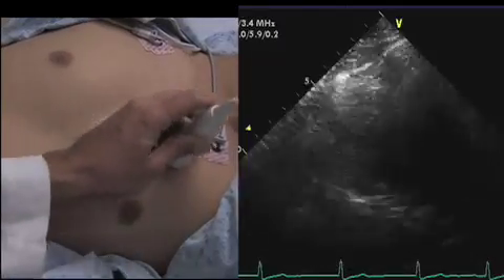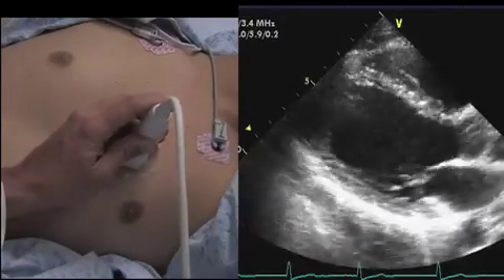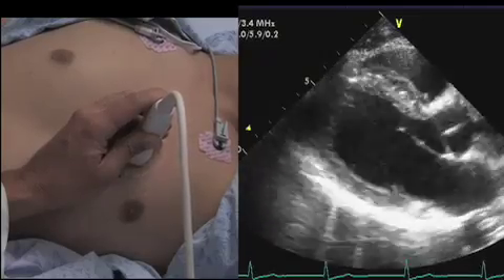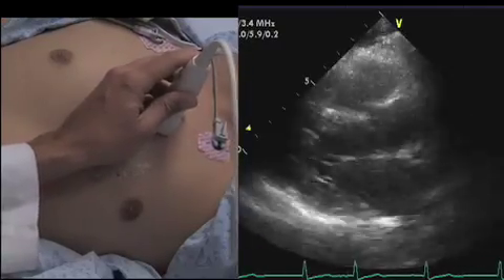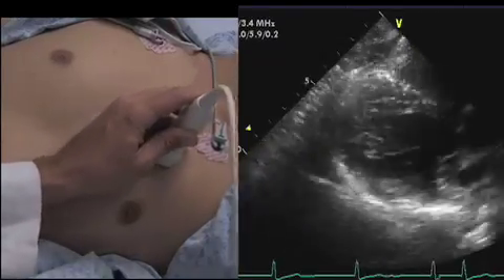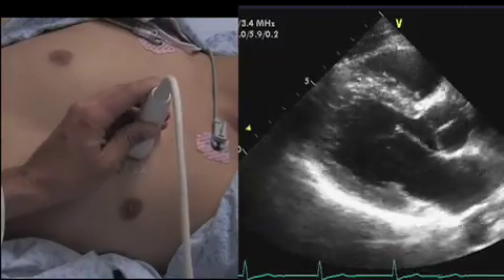The circle survey really helps you stumble into the best possible window and feel confident that you can go back and find what you passed, so you're not tethered to one window that may not be the best for a particular patient. A little bit of work leaving my comfort zone can stumble me into a nicer window, and I can just back right into it.